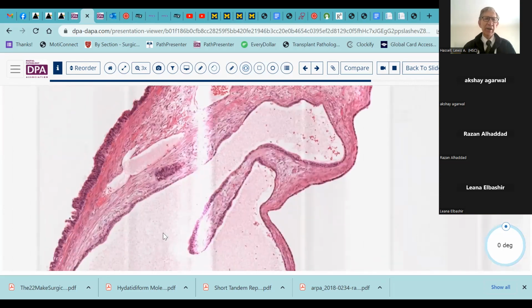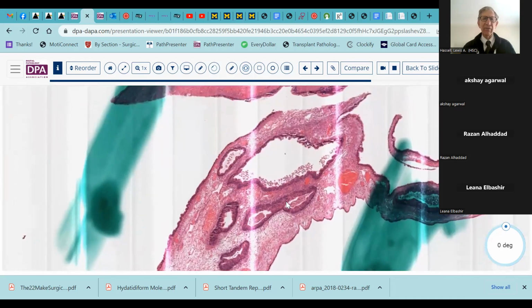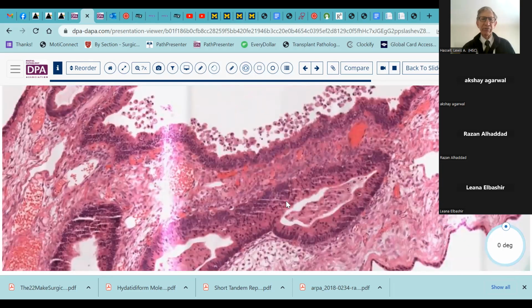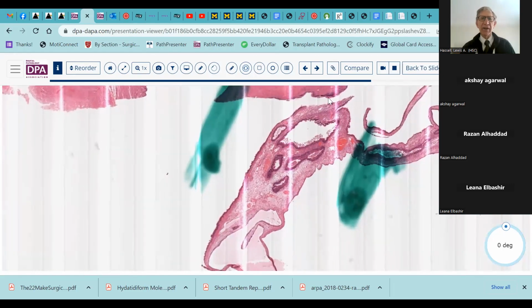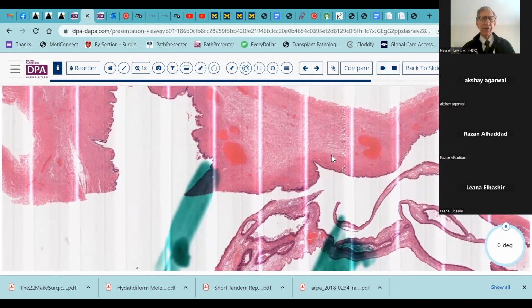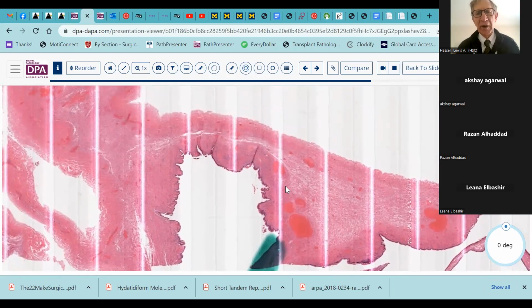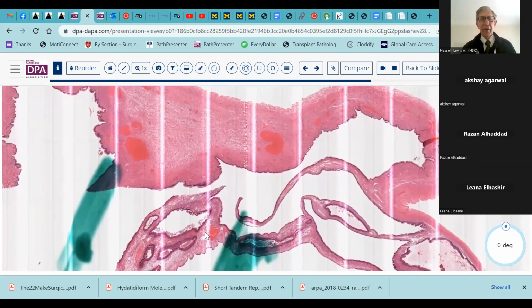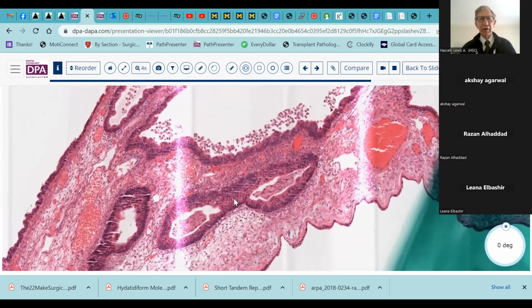Now we also have here this very convoluted structure with some admixed glands, as well as a bit of endometrial type stroma. One of the things you encounter quite early on is when is it endometriosis, when is it an endometriotic tumor, versus when is it just fallopian tube where you've got maybe some endometrioid metaplasia or extension. So we have here the luminal part, but we also have areas of probably serosal tissue with fairly characteristic endometrial type glands.